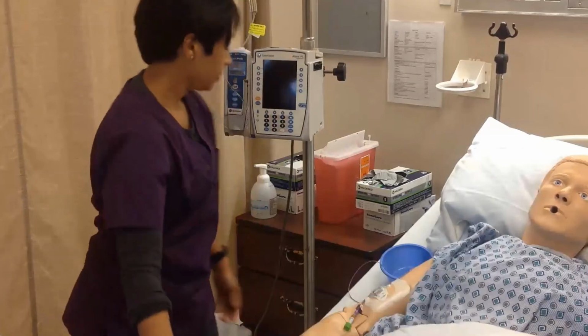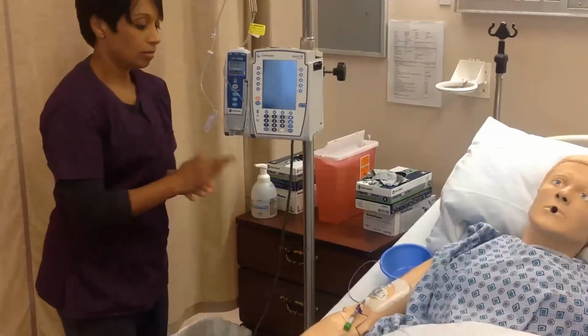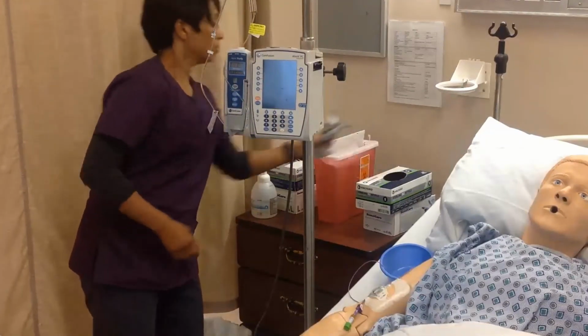Wash your hands. Don your clean work gloves.